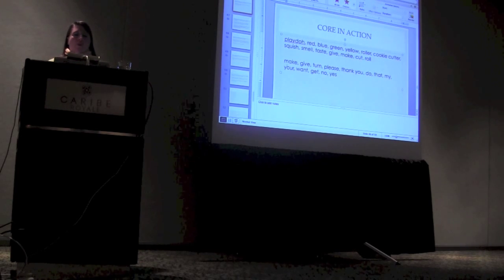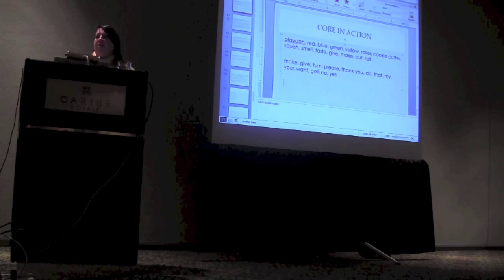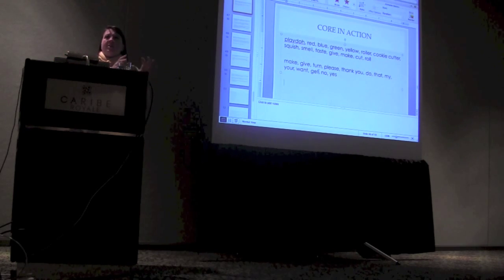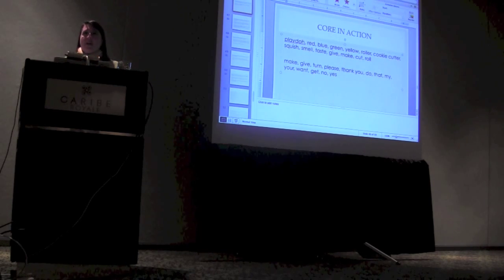So we're playing with Play-Doh, and if we're focused on our vocabulary up here, we could say red Play-Doh. We could say roll green, right? Cut yellow. If we're focused down here, we could say I want that. You do it, right? Not that one. If we're using core vocabulary, we can be using typical language. I used to say, go into the cafeteria, go listen over at that play center and see what the other kids are saying. They're not saying a lot of nouns. They're saying a lot of core vocabulary.